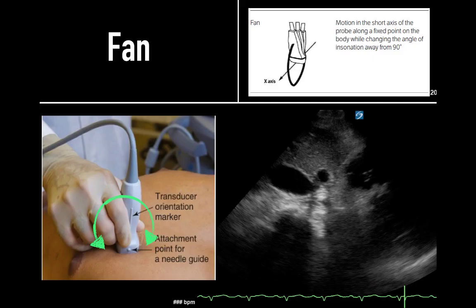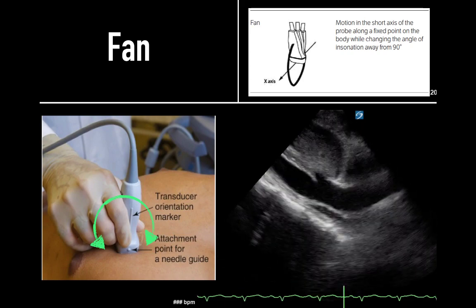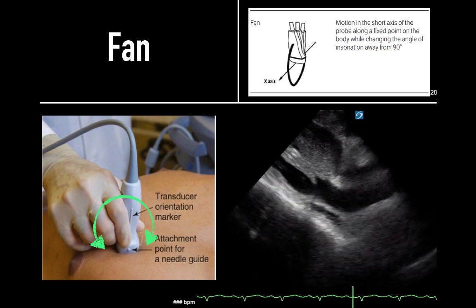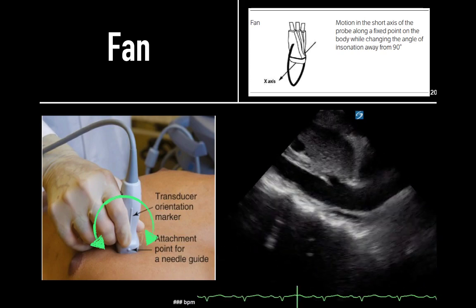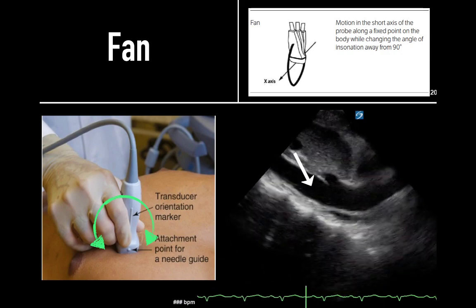If we placed the probe in the subcostal region with the probe marker cephalad in the sagittal plane, then fanning will reveal the inferior vena cava and aorta in parallel with each other. Here is the aorta and the IVC.